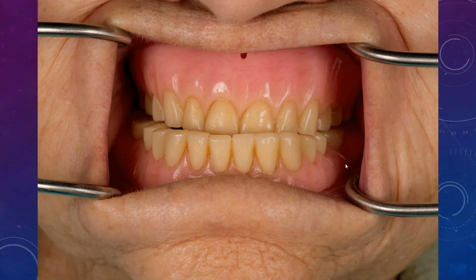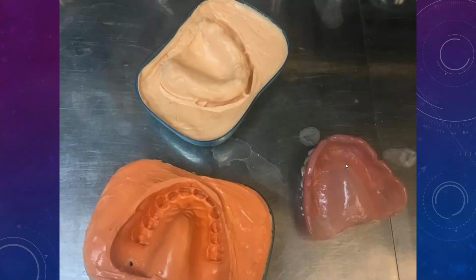There's many ways to duplicate dentures, as I showed you guys. In the days before intraoral scanners were used as commonly as they are now, and before I had a lab scanner, we'd do stuff like this. We could even use like a soap dish to make a duplicate impression of the denture.